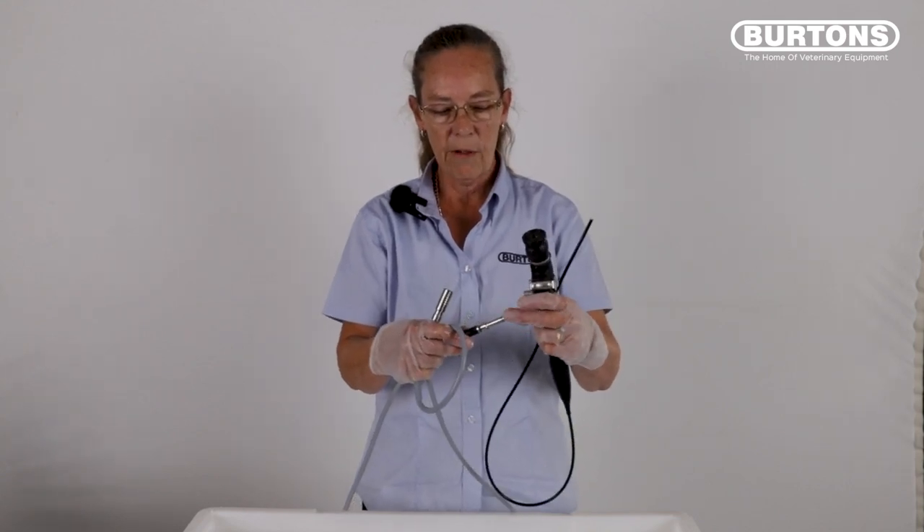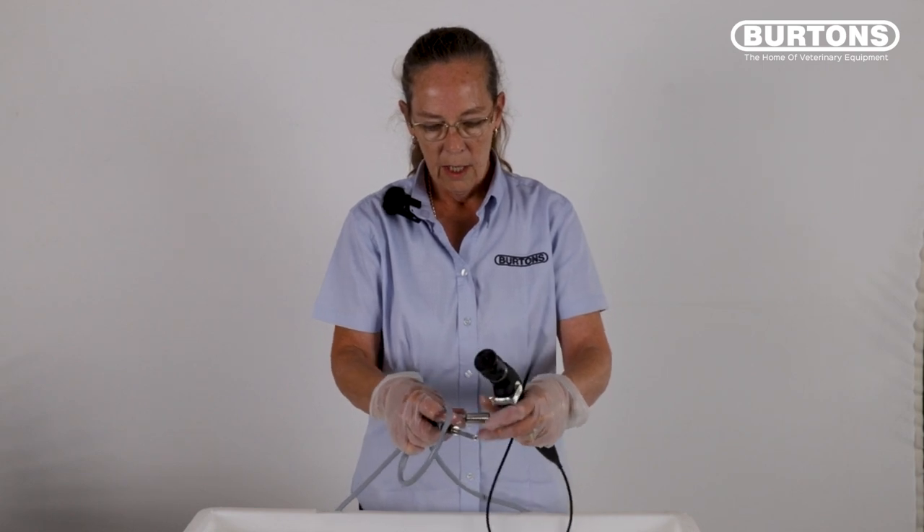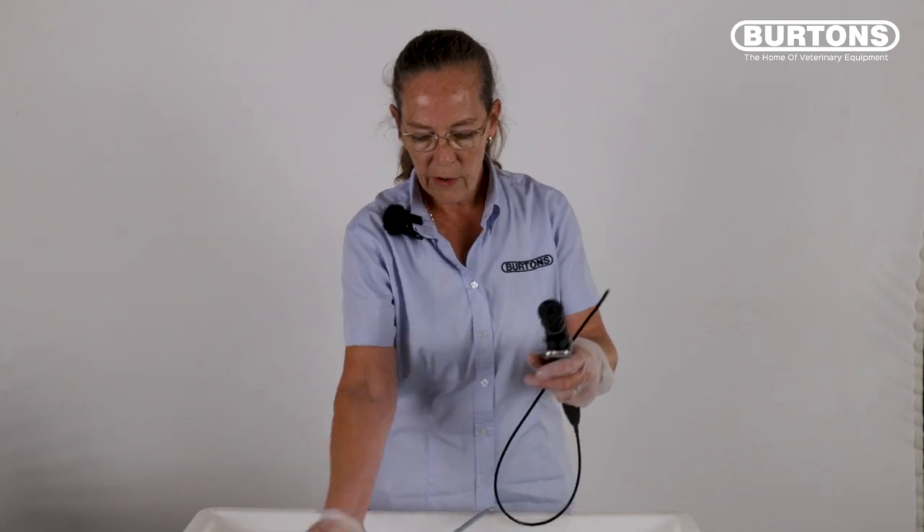Remove the adapters from the end of the light guide cable. If using the wolf adapter, you also need to remove the collar from the light guide post — be careful that you don't lose this. This area will need to be cleaned.